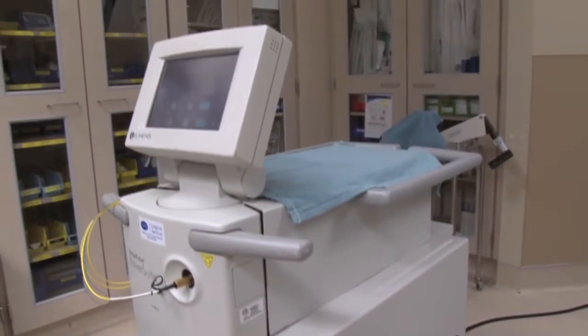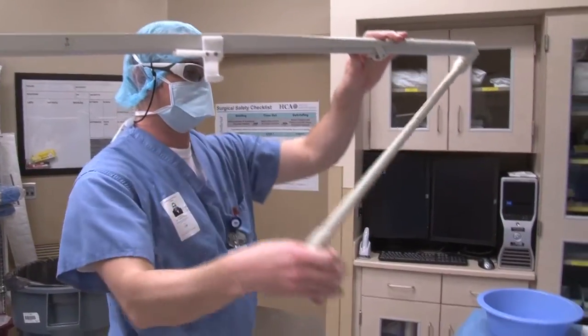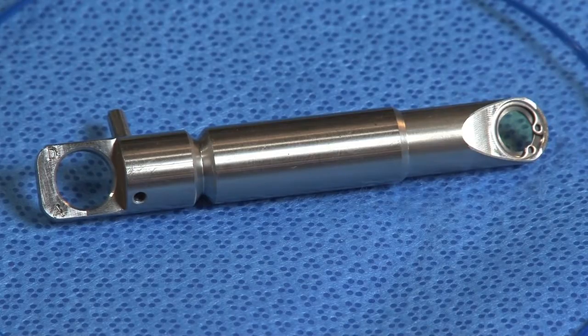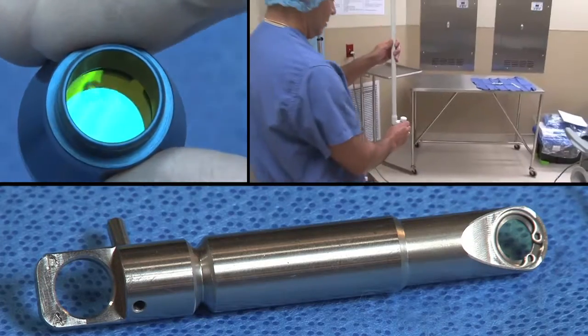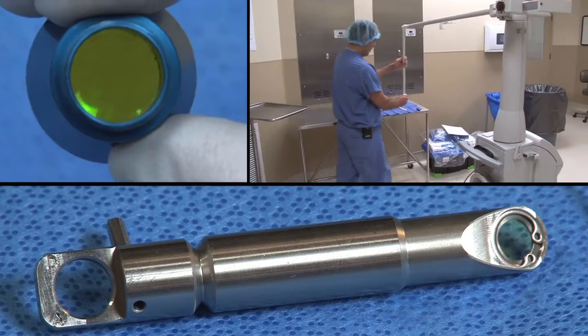Lasers utilize a variety of optical devices. An optical device can be as complex as an articulated arm or as simple as a focusing lens or debris shield. Each optical device serves a specific purpose and is an essential component in the laser's operation.